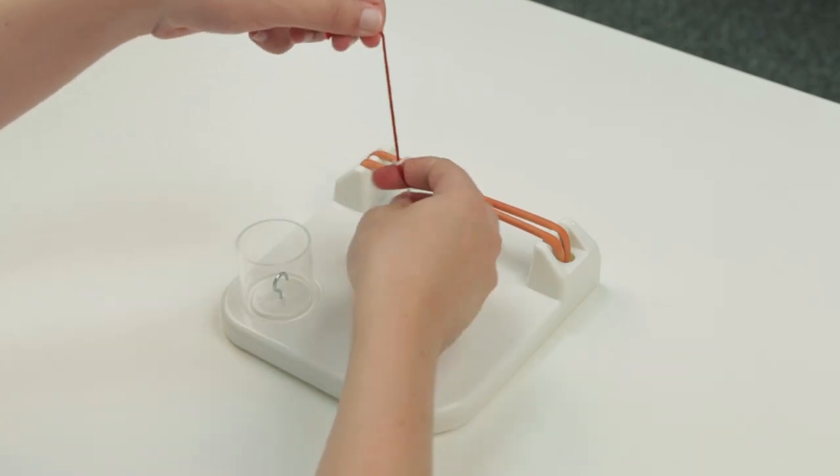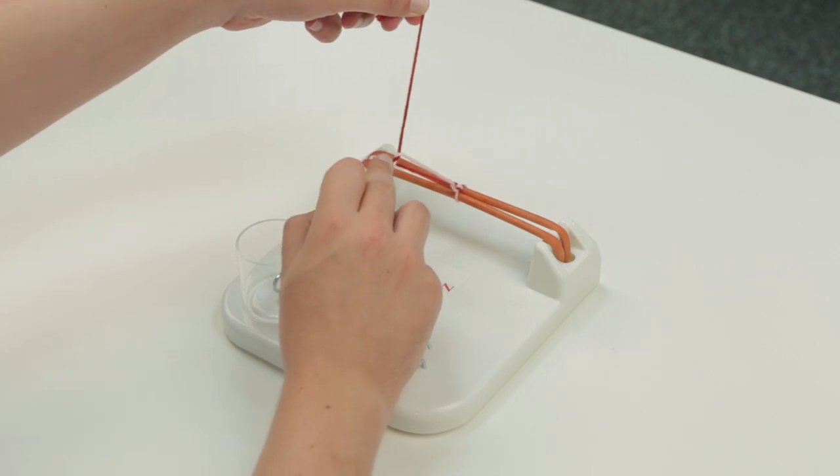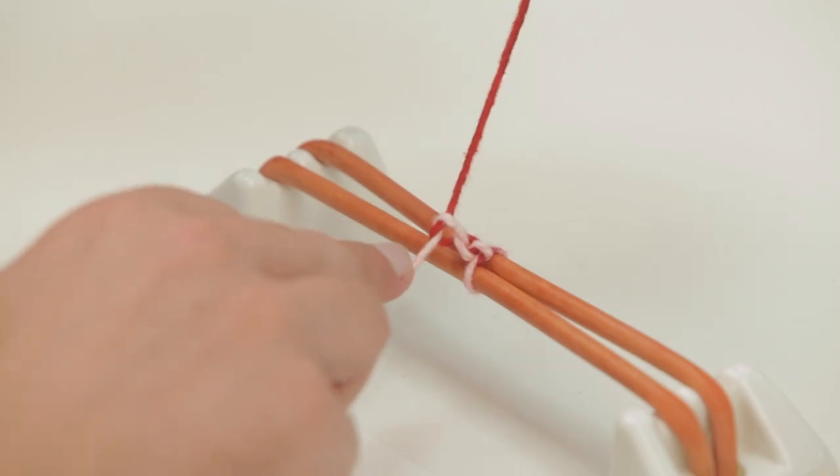Multiple throws can be used to hold a more secure knot. Typically this will be three throws for a braided suture or five for a monofilament.